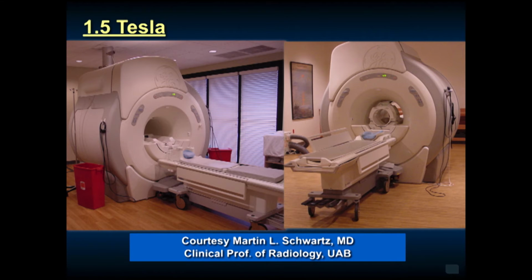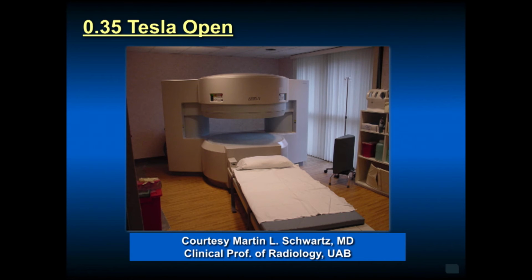So these are some of the examples of the machines and what they look like. This is a 1.5 Tesla machine. Claustrophobia can be a problem, but the open magnets aren't as good a magnet as the closed ones. This is an open 0.35 Tesla magnet. This can be okay for certain joints like the knee, some shoulders, but it won't give you the definition with hips or for a labrum tear of the shoulder.